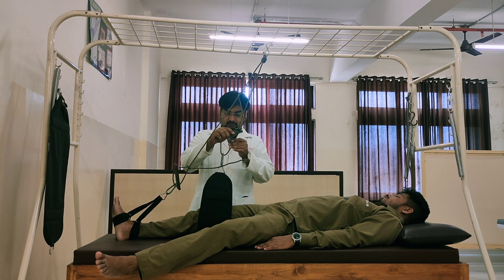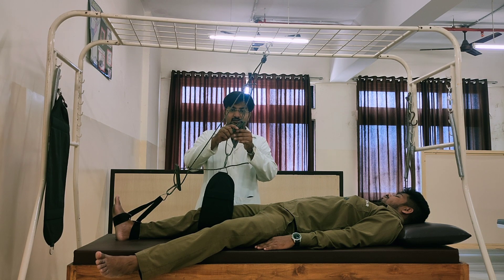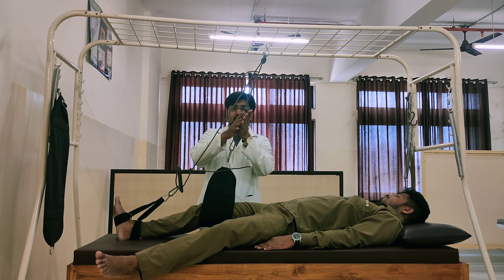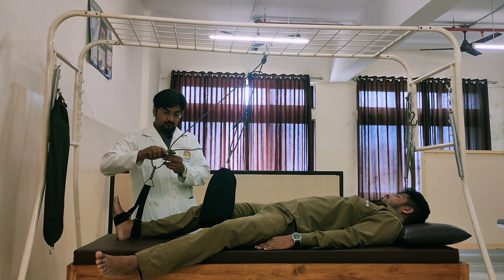Now we have to adjust the length of the rope. Always while adjusting, just keep the wooden tilt horizontal, adjust it, and then make it oblique. It should be firm. Then, same for the distance.